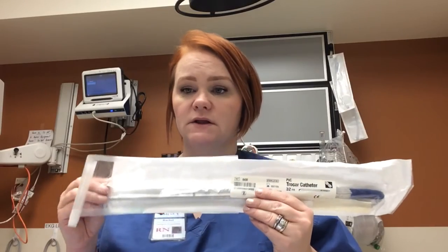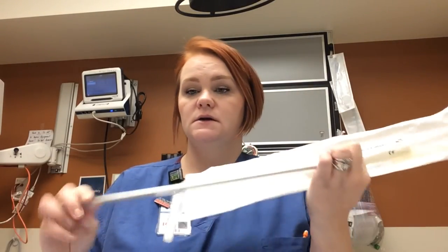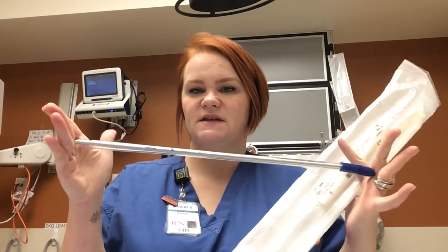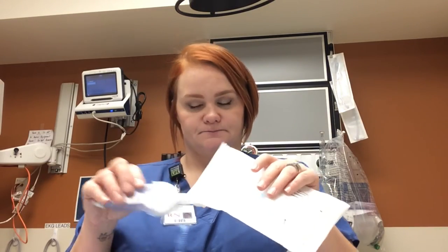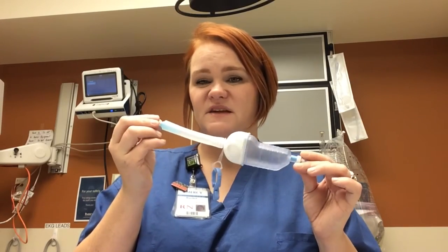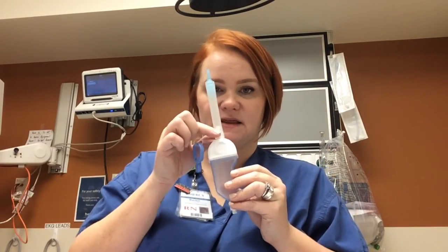After that's placed, the physician will decide which device they want to use. The physician may want to use a trocar or the large bore chest tubes. These are typically used in our trauma patients, anybody with a hemothorax, but they're the ones with the metal piece in it. Or the physician may want to use a Pneumostat, and these are typically used with a pigtail device or the pigtail chest tube. They may be used with a smaller gauge chest tube, but these devices are typically sent home with patients, or they just have a small pneumothorax that they want to fix instead of watching, but these devices are also kept in the chest tube bin.